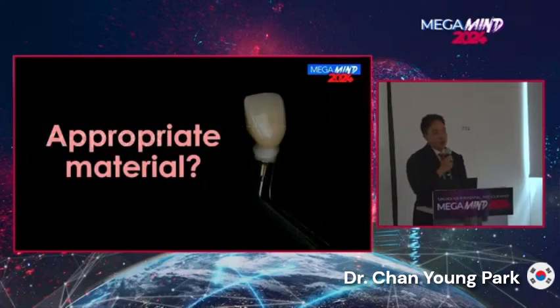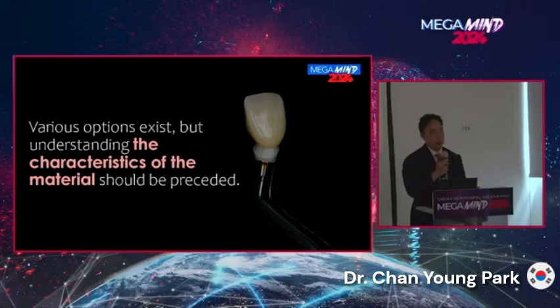So what is the appropriate material for the final prosthesis? Well, there are many possible options, but whatever option the clinician chooses, it is important to understand the characteristics of each material.